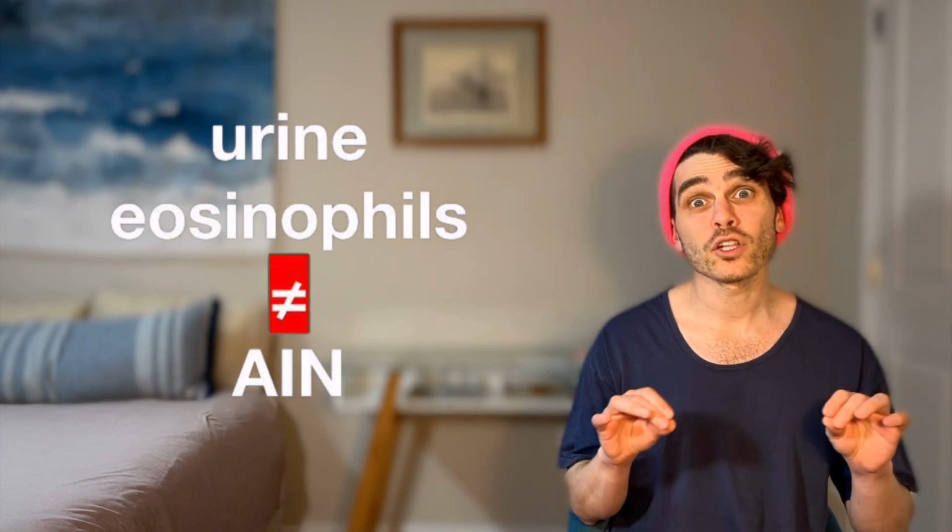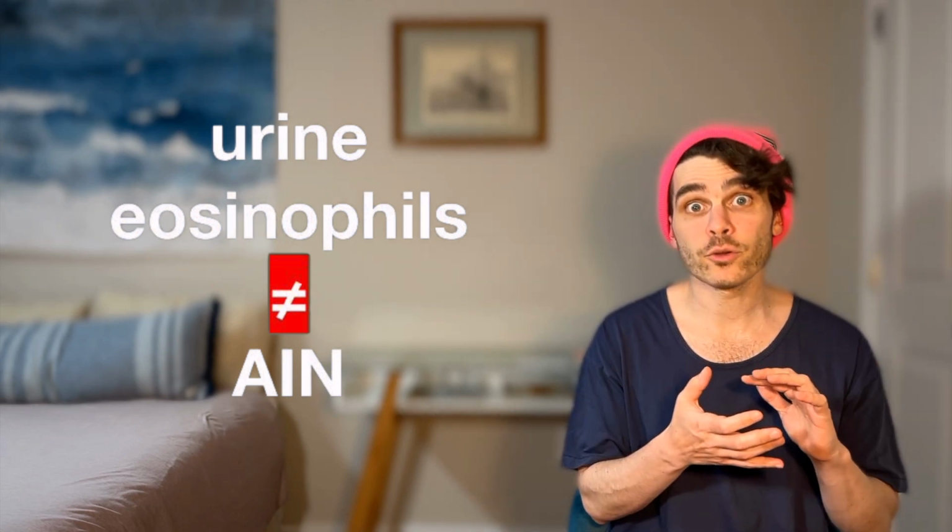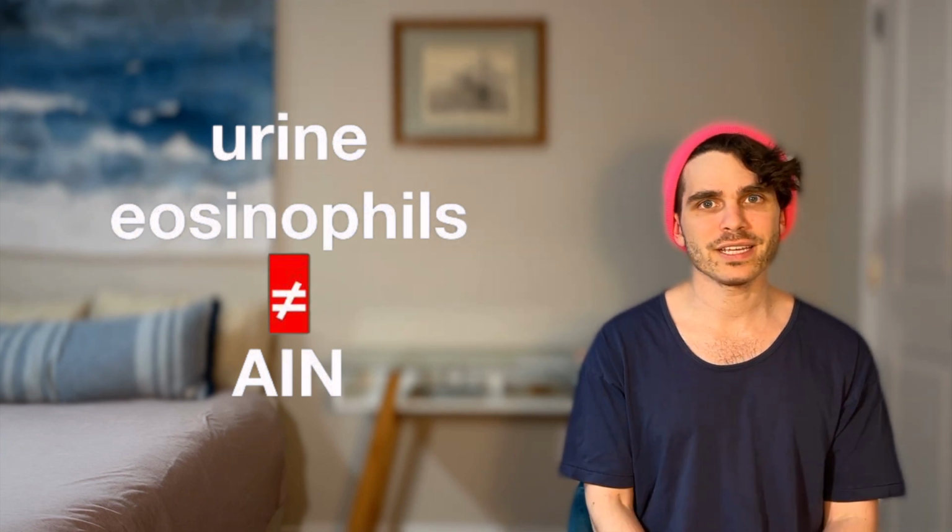Second thing I'd like to say is I want to debunk the myth that eosinophiluria is specific for the diagnosis of acute interstitial nephritis. AIN is notoriously difficult to diagnose, and the presence of eosinophils in the urine isn't particularly sensitive or specific for a diagnosis of AIN.